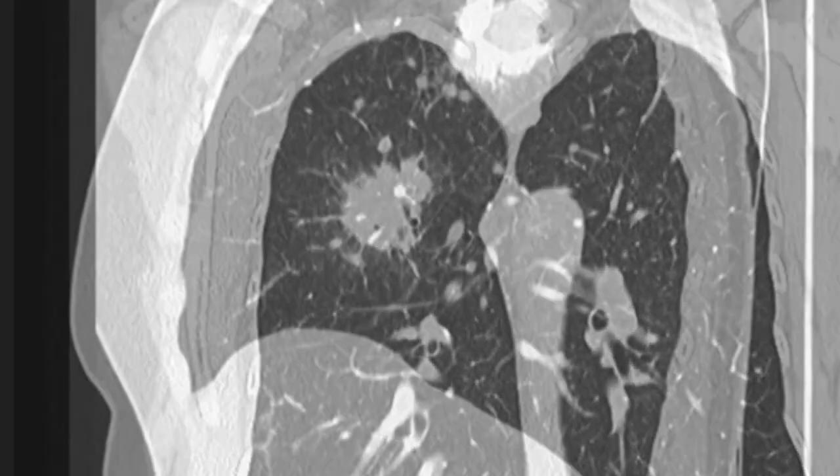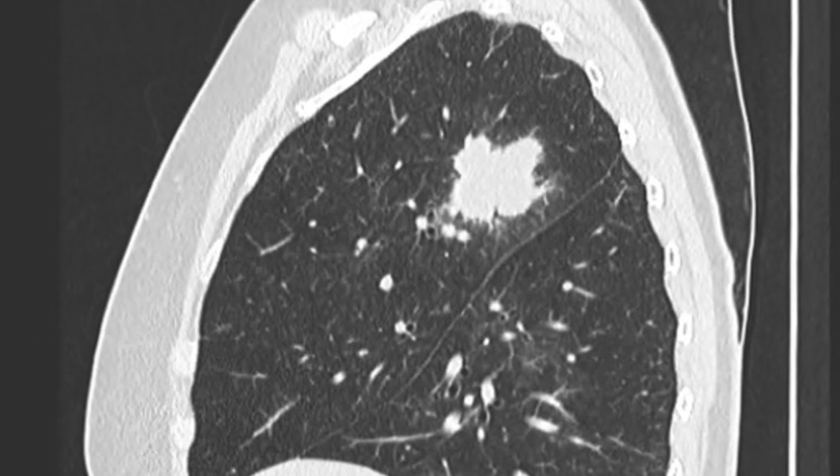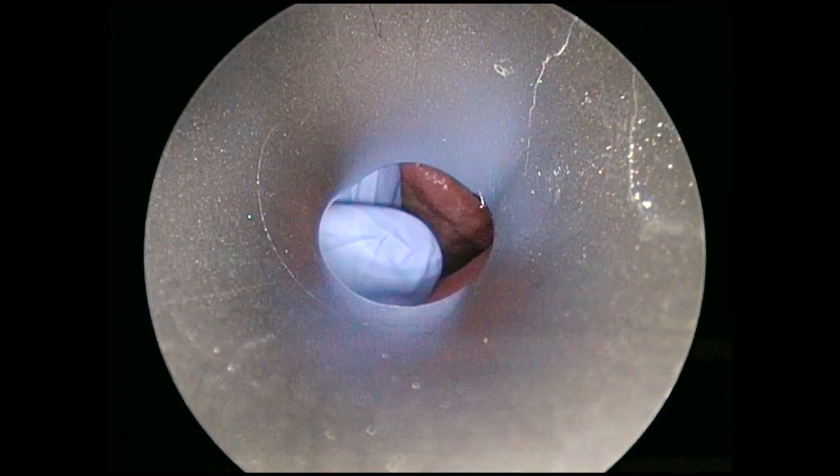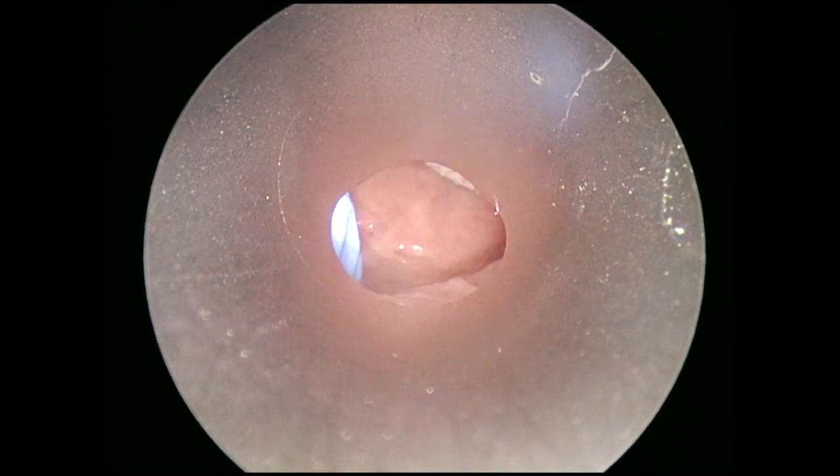Prior to the procedure, radiology is vigorously examined with attention to airway anatomy. In this case, RB2A is thought to be the best location to biopsy.